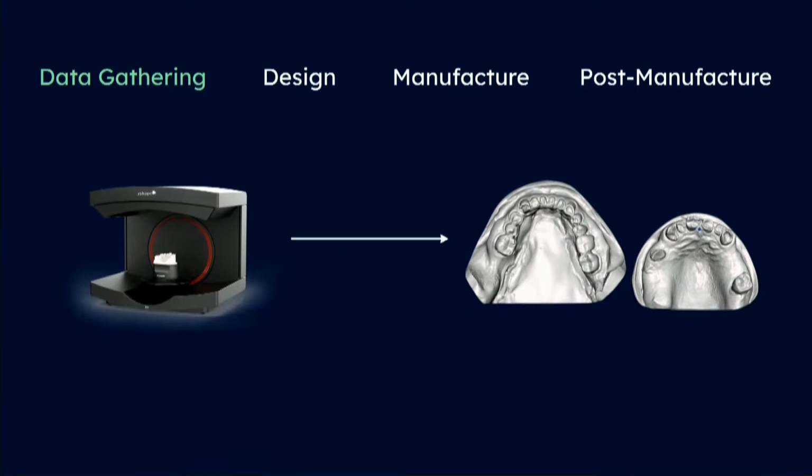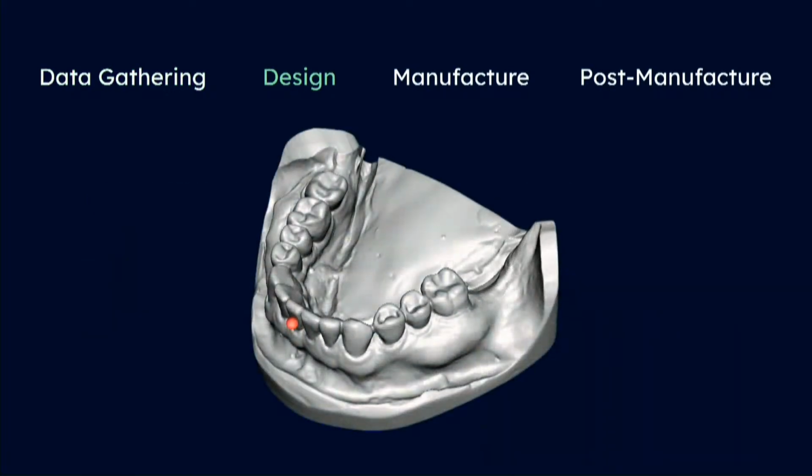In this case, the patient's dentition was digitized via desktop scanning of his stone models. A quick mandibular design to restore a harmonious occlusal plane revealed central and lateral incisors that are non-restorable due to lack of future ferrule effect. Moreover, although crown lengthening may aid in this regard, elective endo would be needed in all of them to produce a core that is able to retain the future full coverage restoration. And unfortunately for the patient, finances were an issue here.